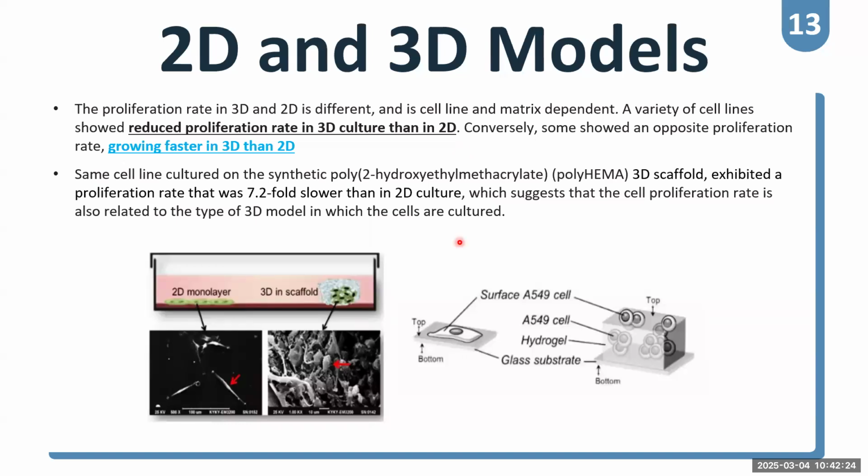Okay, so in this slide, another thing to show you is that they have now developed scaffolds like this to provide the structure for 3D cell culture. And the scaffold you see here has pores, which increase the ability of the media and oxygen to pass through the 3D structure and enhance 3D cell culture proliferation.